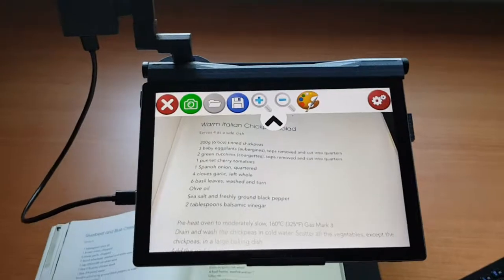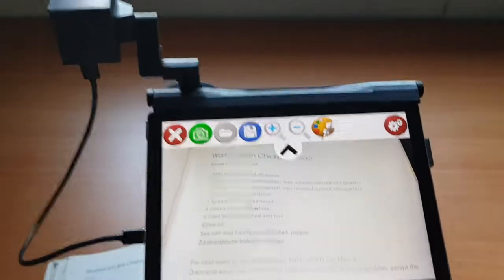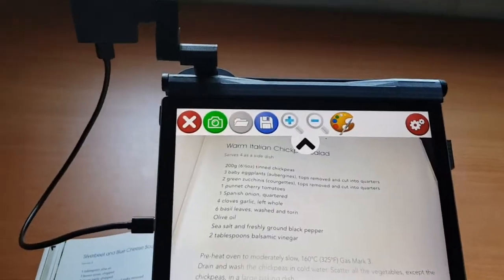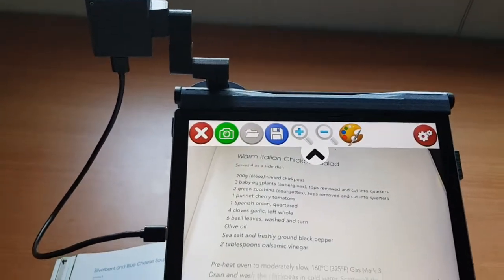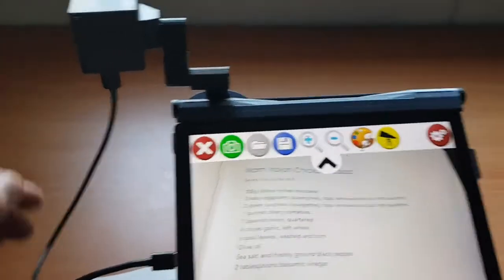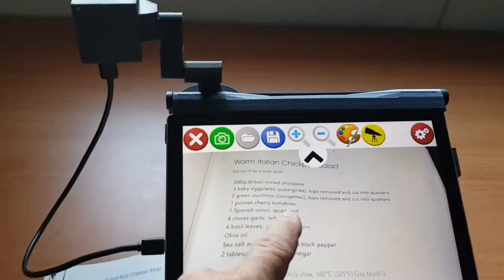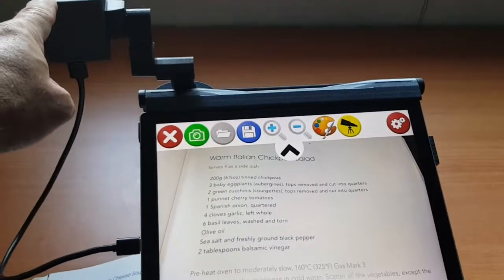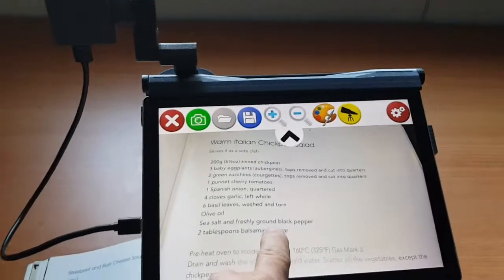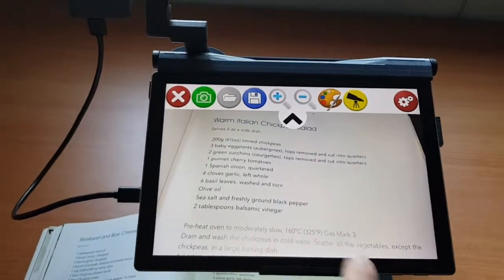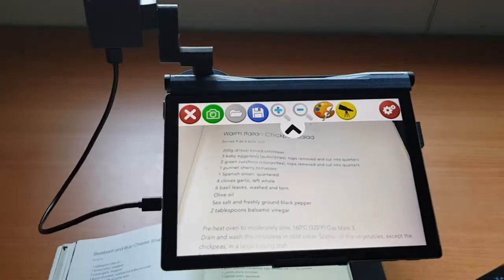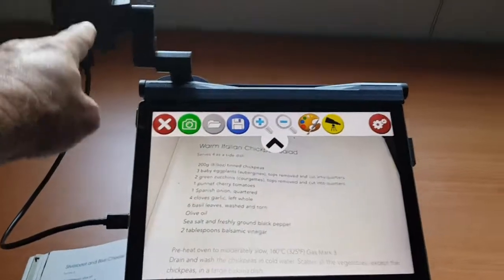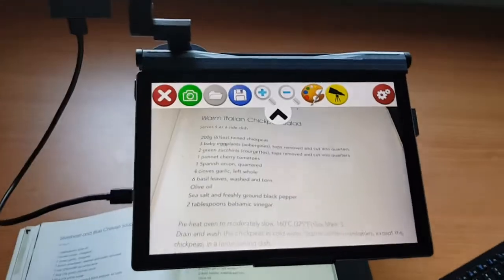Now the reason why it's done USB is twofold. One is to provide power to the camera, and two is so that we do not need to rely on some kind of Bluetooth or near Wi-Fi connection between the camera and the Surface Pro. Because what we want to achieve is that the Surface Pro has the ability to hook into school Wi-Fi networks without having to be hooked into a camera Wi-Fi. So this is why we use USB here.